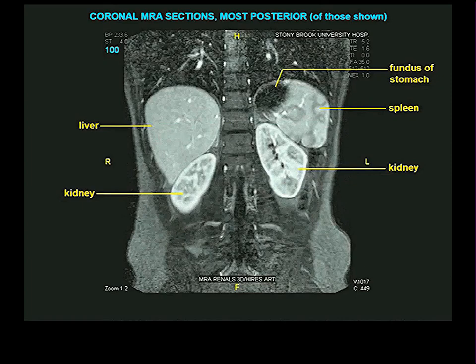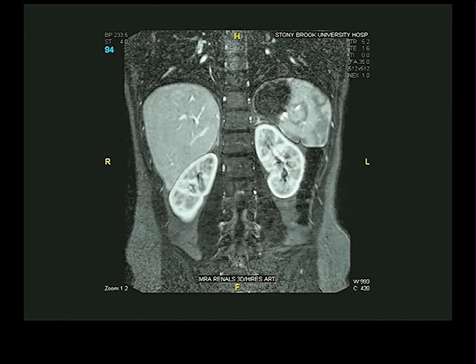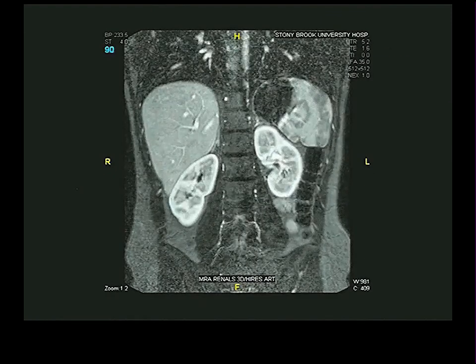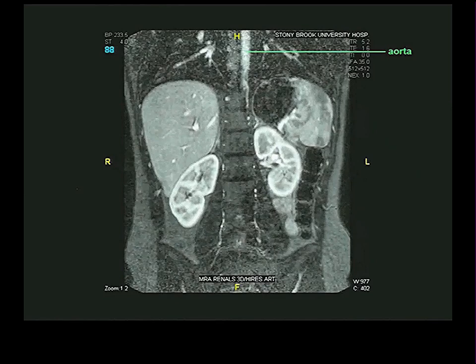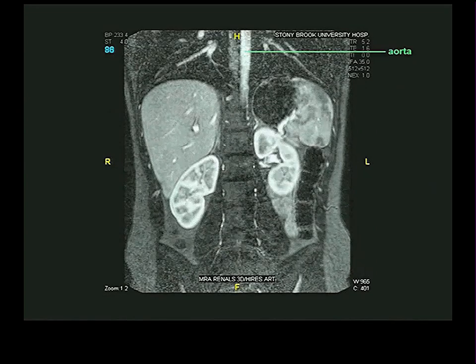All right. We go forward one level. Forward, nothing changes. Forward, nothing's changing. Forward, nothing. We come into, there's a magnetic resonance angiogram. So arteries and veins to a certain degree, depending on how they are going to appear, white. And we're seeing now a linear structure forming on the left anterior side of the vertebral column, so that is where our aorta is. Spleen, stomach, liver, and kidneys haven't changed.